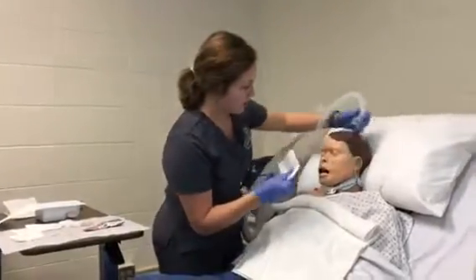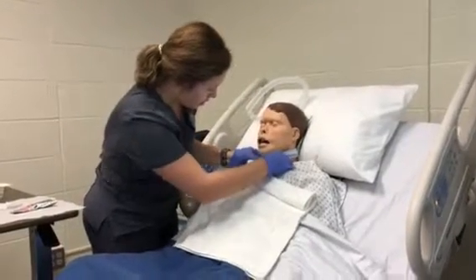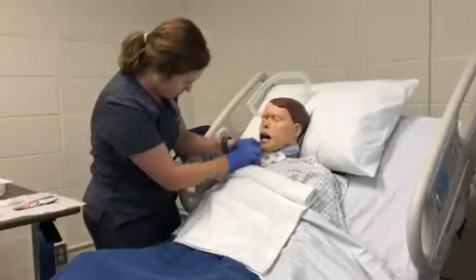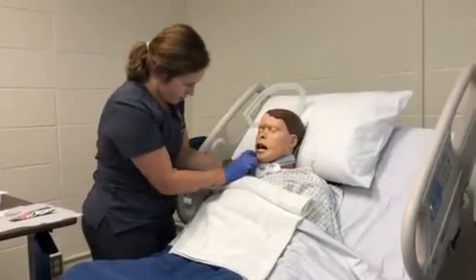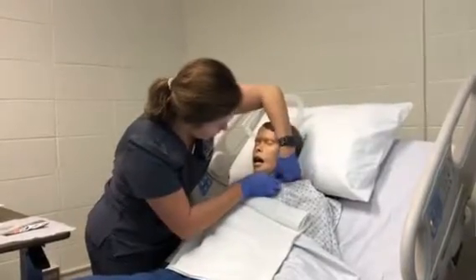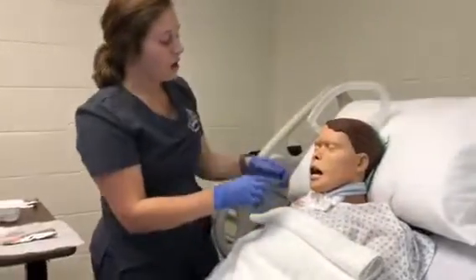We're going to move the oxygen back out of the way. We're going to put this under the trach. Okay. And now that that's all nice and clean, we have a new dressing under there.